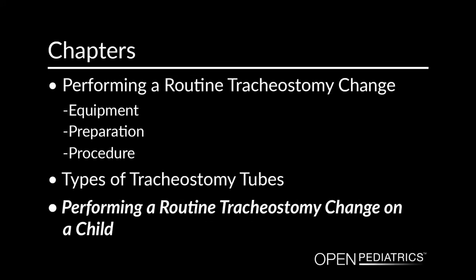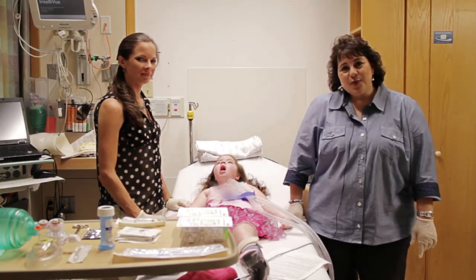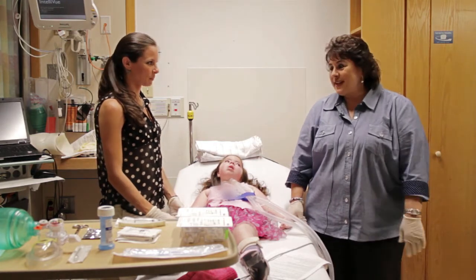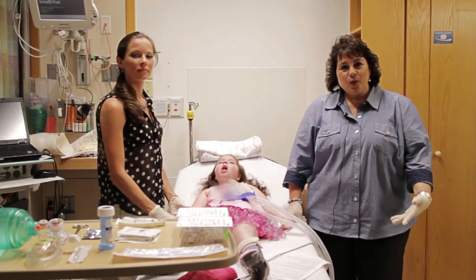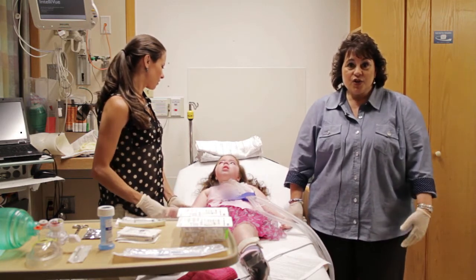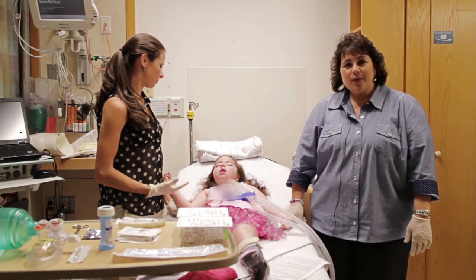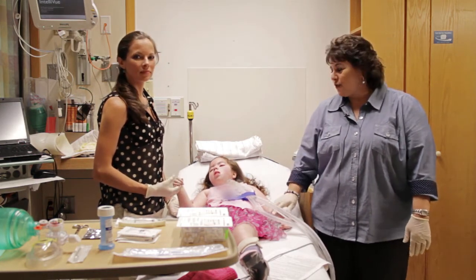Performing a routine tracheostomy change on a child. Today we have Drew, who is 5, and her mom April with us, and we're going to perform together a tracheostomy tube change and help you to learn how to do it with your child. We are following the Children's Hospital Boston guidelines for the tracheostomy tube change, so I will review the procedure and the equipment that we have here in preparation for the tube change prior to that change with Drew.